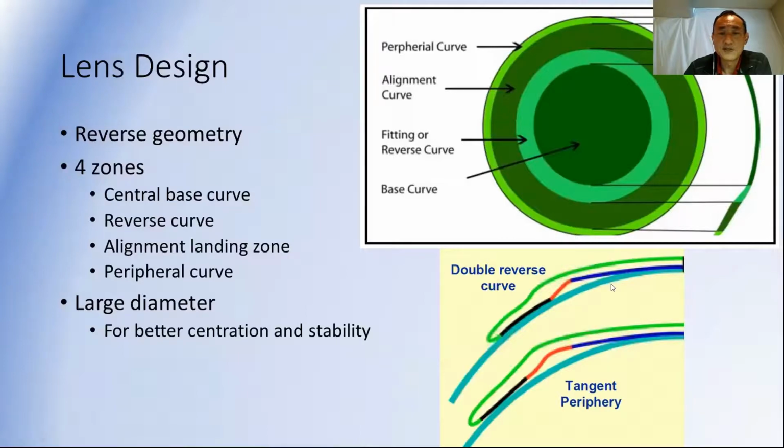Should kids with intermittent exotropia and myopia be considered bad candidates, considering they need constant clear vision to control their strabismus? Possibly. One thing that can help exotropia is if they have to accommodate a little bit. And with Ortho-K treatment, they don't necessarily accommodate more or less than other types of treatment. It's not necessarily a contraindication, but if you're counting on some accommodation to help them control their exotropia, then Ortho-K may not be the right kind of treatment for them.